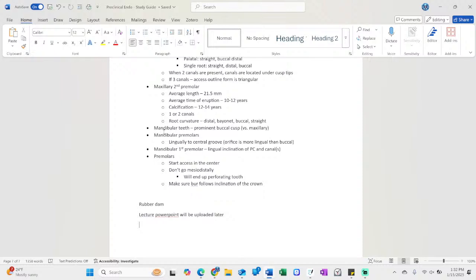So like I said, we've got a frame here. This frame we often use for endo as opposed to this one. Anybody know why? Yeah, this is going to show up on your radiograph. And then various sizes of rubber dams. This is Dr. Lily's favorite.